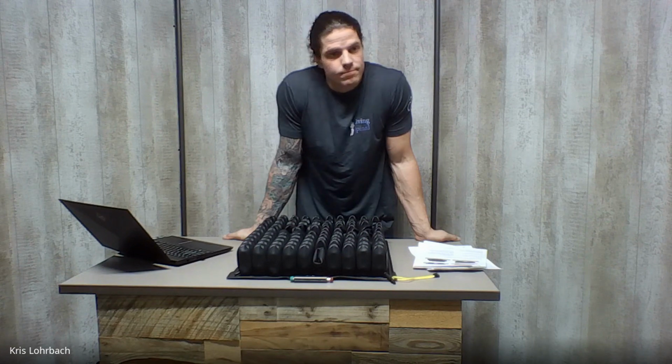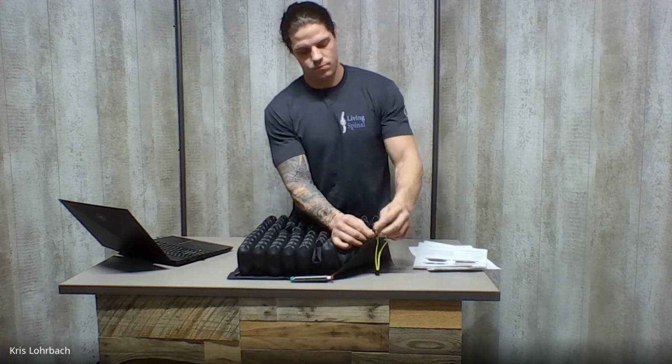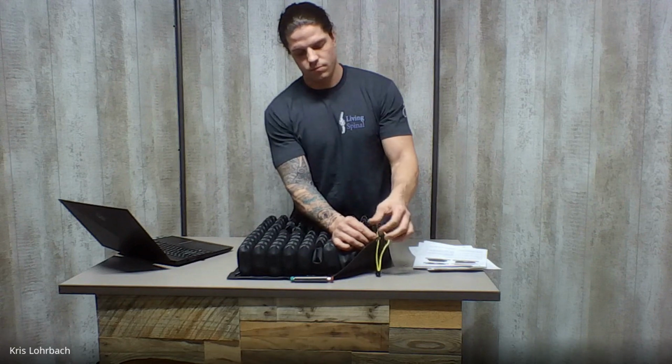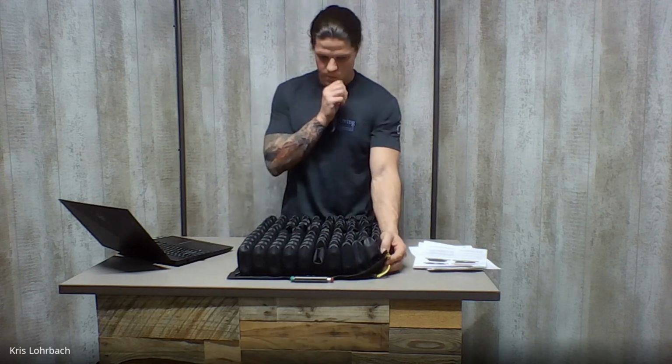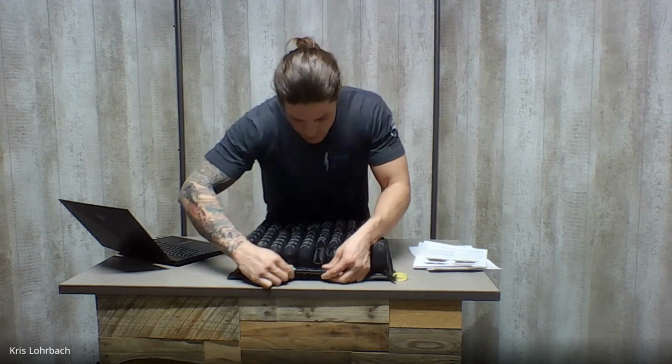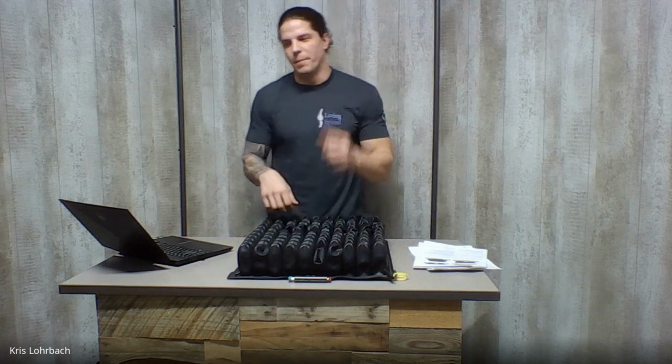Now, how often do you have to refill it with air? That valve over on that side is the amount of air that's in the entire cushion, right? So you would push it over to green so that they're all flowing, and then you can literally just put your mouth on it and blow it, but it does come with a little pump, right?